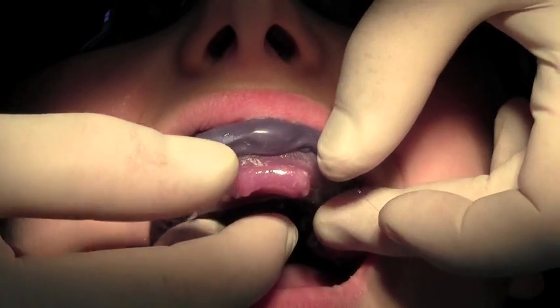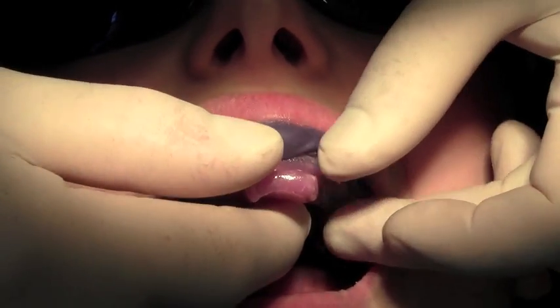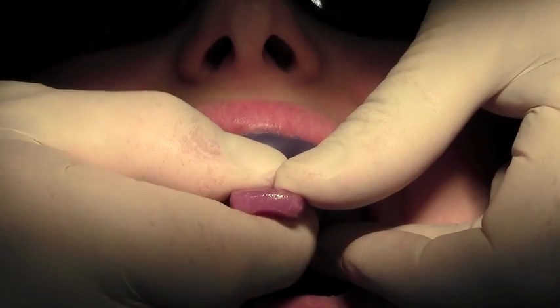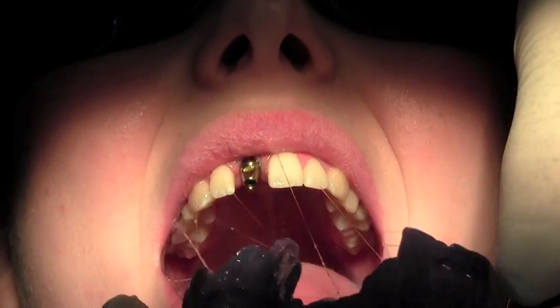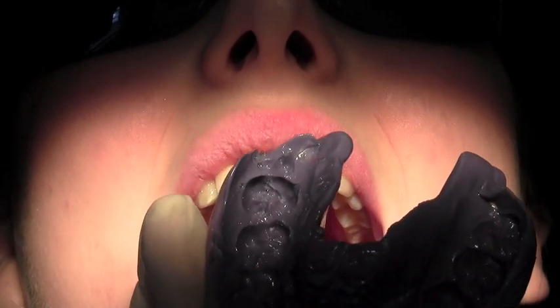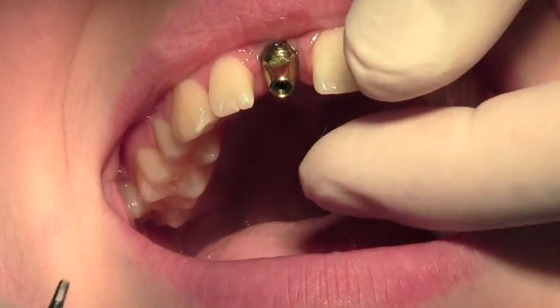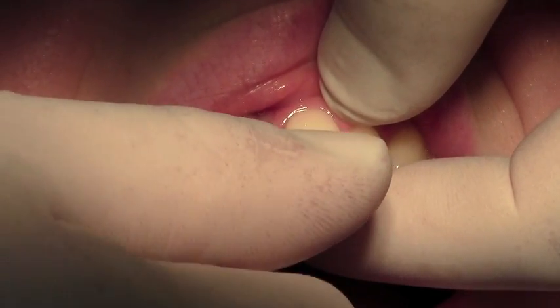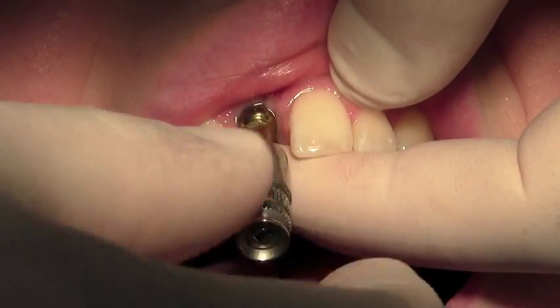Here we are with the set Impregum impression in the special tray and we're just going to remove that. Now that the impression has been taken, we're going to remove the impression post with the 1.22mm driver again.